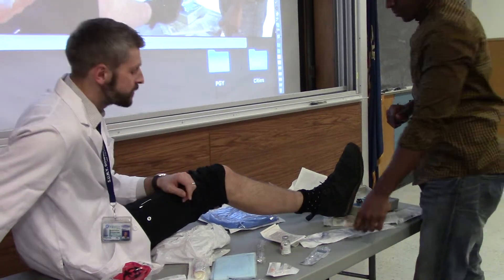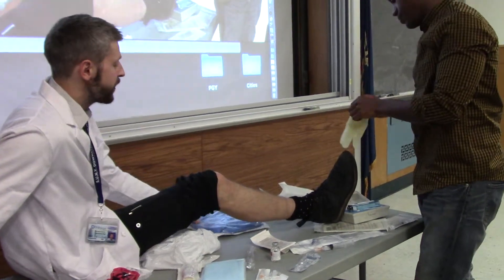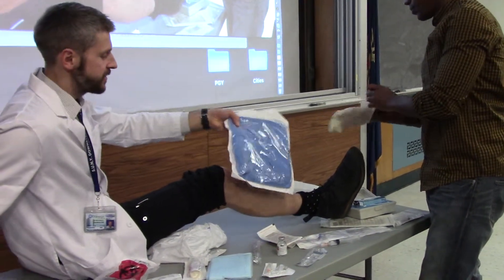The take-home message is: don't flood it fully. Now, with a real patient you'd have one set of gloves, someone else, and a drape all over this — but I want you guys to be able to see everything.